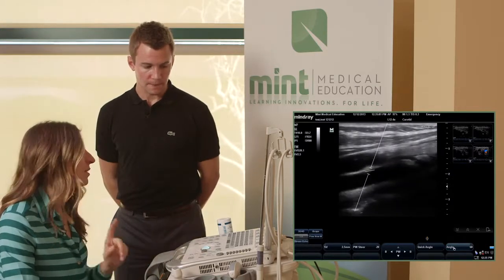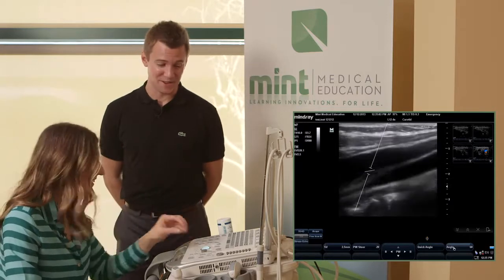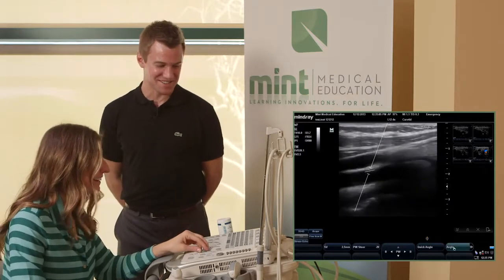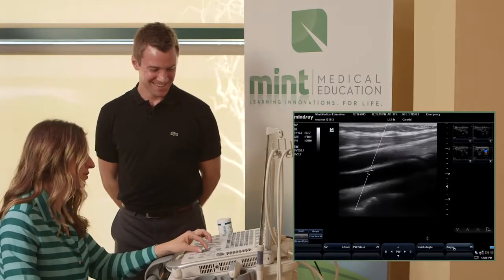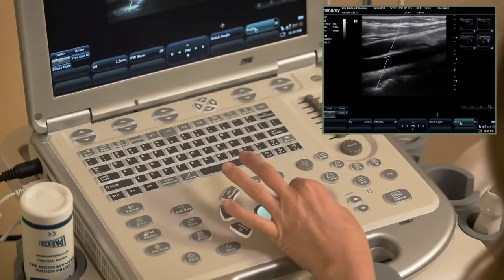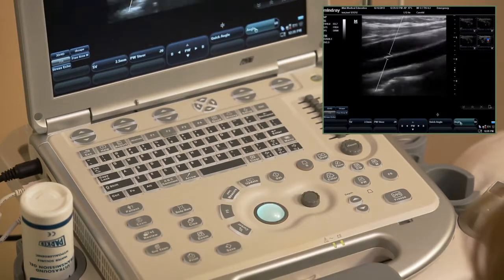And you're always going to want to be at 60. If you go over 60, then we might run into some issues. You might want to rethink your approach. So most of the time, you should use the rotary dial if you're going to have to change it off of 60. Correct. That makes sense.